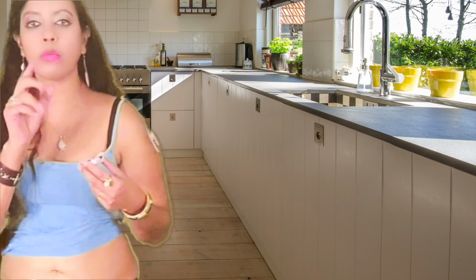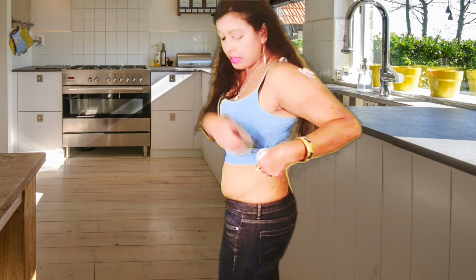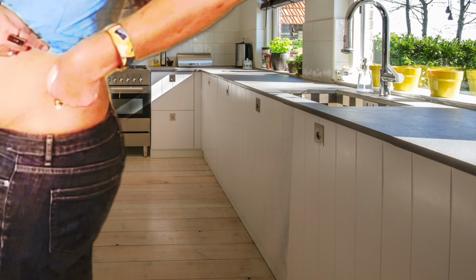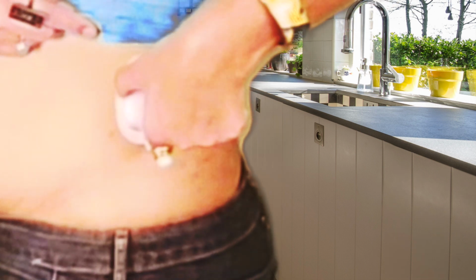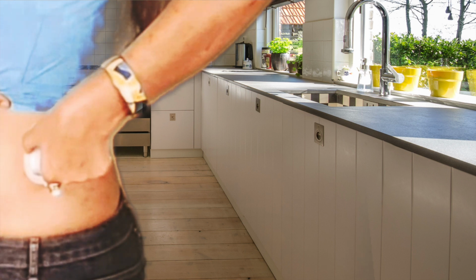Important for you to determine which side you want the needle to go on, all right? The narrow part of it is where the needle is. The flatter surface, the base of the part, is where the needle is not. So I am deciding, I'm going to do it from this angle so you guys can see. I am deciding that I want the needle to be the bottom. So I'm wearing my part this way, vertically, okay?